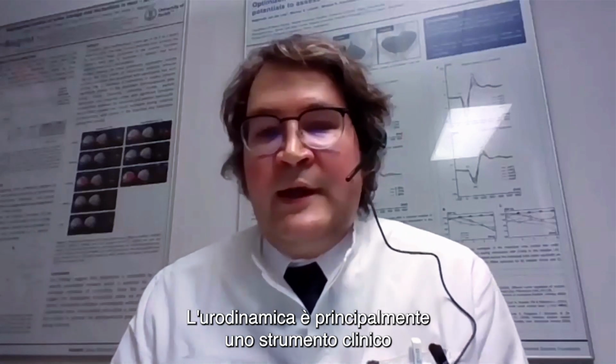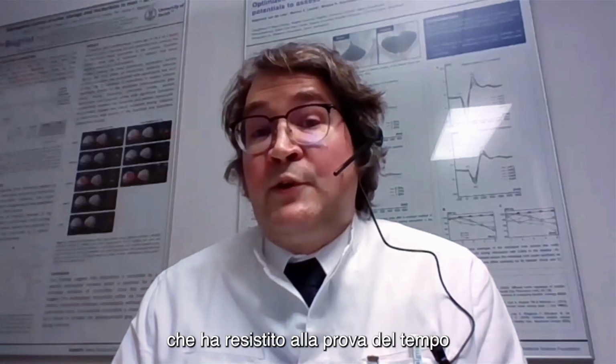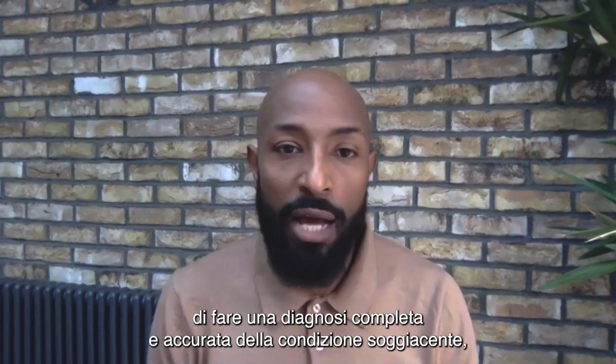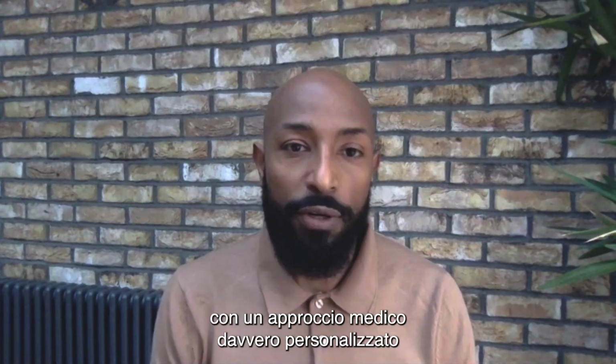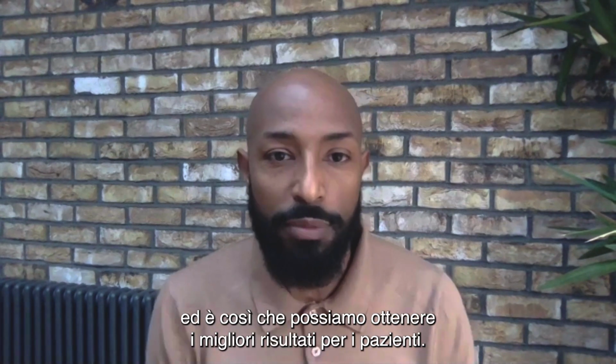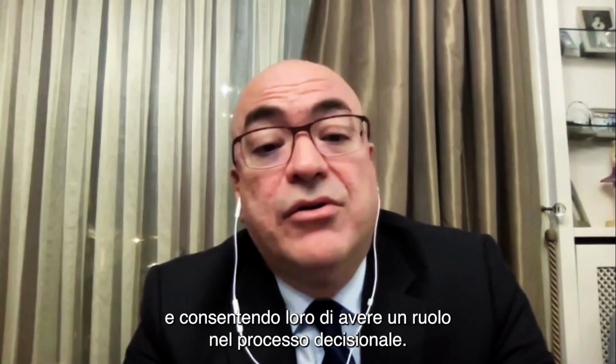Urodynamics are primarily a clinical tool for diagnostics of lower urinary tract function, and it has stood the test of time from its first application nearly 1 century ago. Here we have an opportunity to fully and accurately diagnose the underlying condition, better treat it, offering true personalized medicine, and really then is where we can achieve best patient outcomes. Urodynamics represents the only investigation that objectively evaluates the lower urinary tract function and dysfunction, improving surgeons' understanding of their condition, facilitating counseling, and enabling patients to play a role in decision-making.